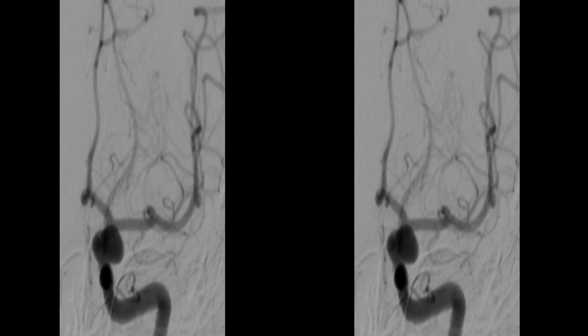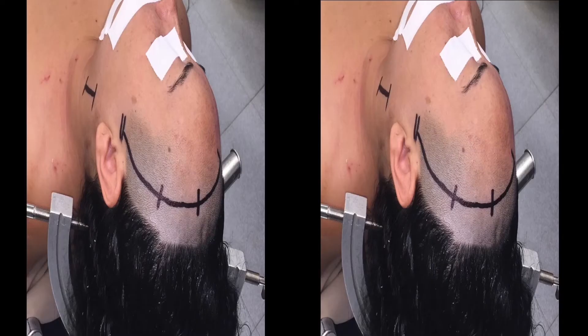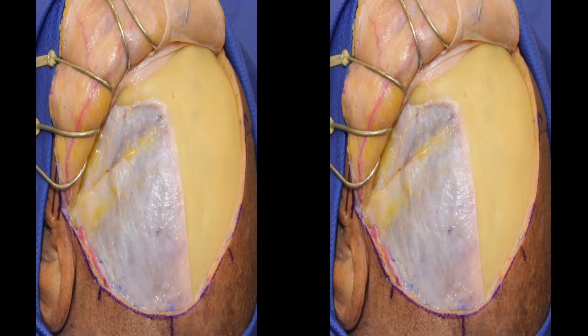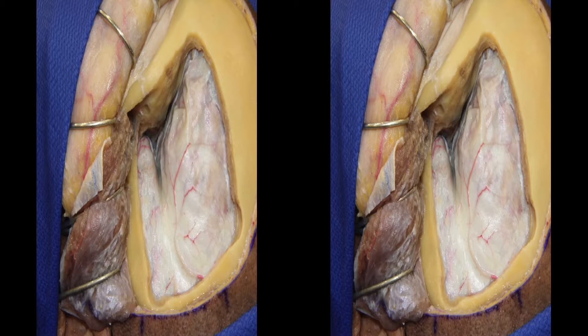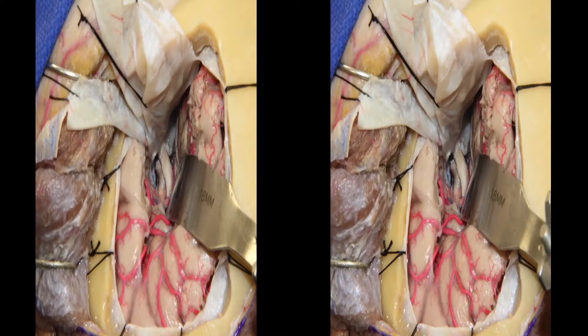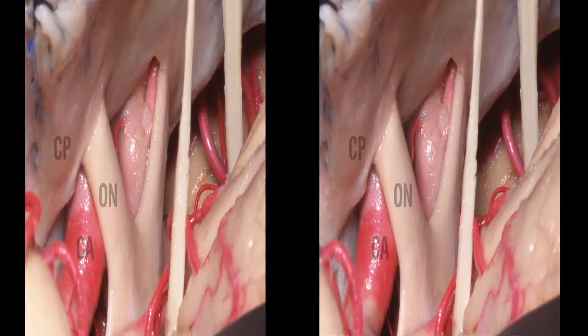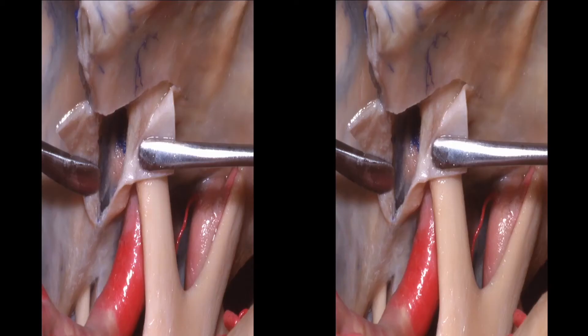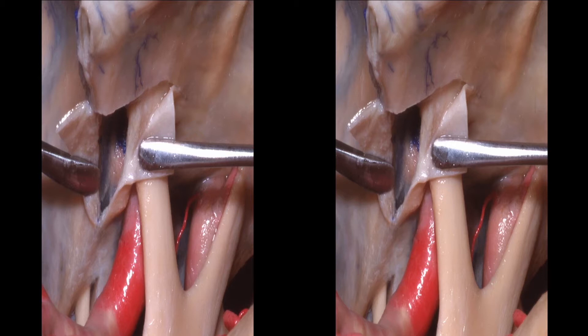A left pterional approach plus exposure of the left internal carotid at the cervical level was performed. In this anatomical specimen, a left pterional approach is demonstrated: frontotemporal craniotomy with drilling of the lateral orbital wall. An anatomical exposure of the optic nerve, clinoid process, and carotid artery was performed. After the clinoidectomy, we can observe the lateral surface of the clinoidal segment with lower and upper carotid rings.